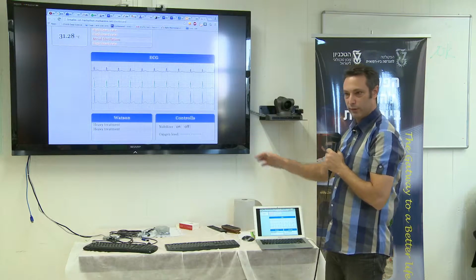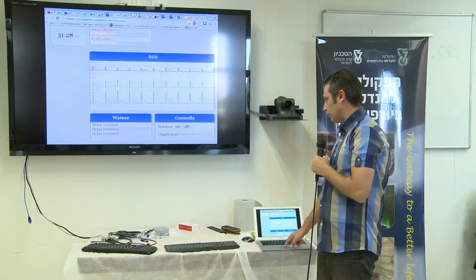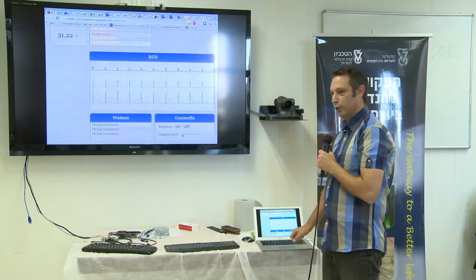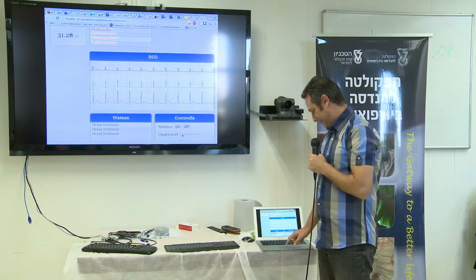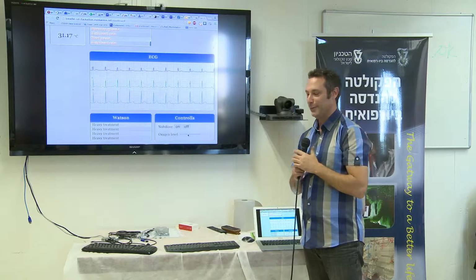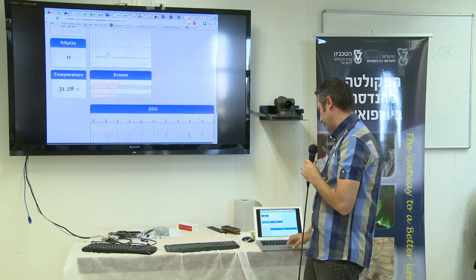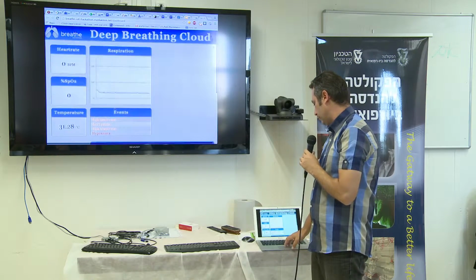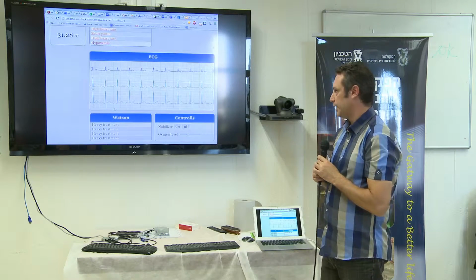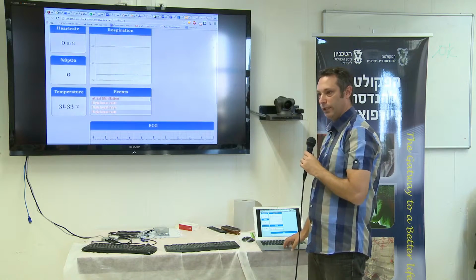This is kind of a mock of Watson, but the idea is it will give us some data about how to treat him. And then we have controls that he can turn on and off, stuff like a nebulizer. I can try and kill him and lower the oxygen level. And we can hear him choking up back there. But the idea is that we will do it automatically. Based on what we monitor here, and based on the oxygen levels that we get, we can automatically flow more oxygen to him. So that's basically the system that we built, and it's at least partially running.